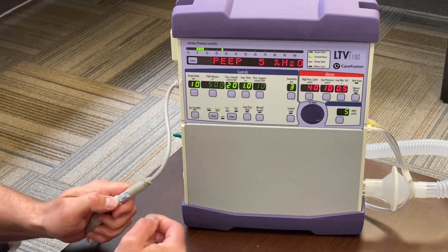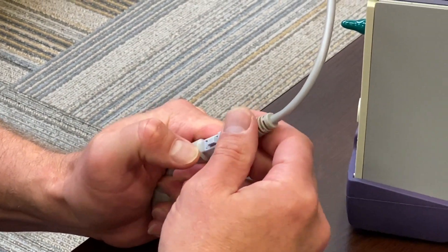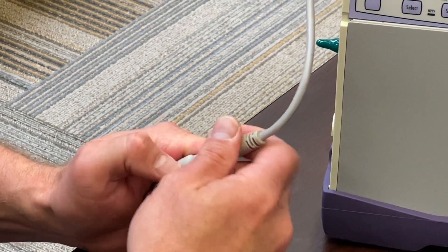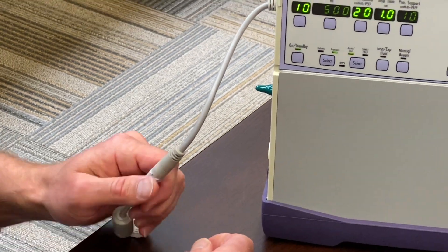On the power supply cord there is a button that has to be pressed when removing or plugging it in. If you ever accidentally force this out and break this piece, it will no longer stay plugged in and you will constantly have power failures.